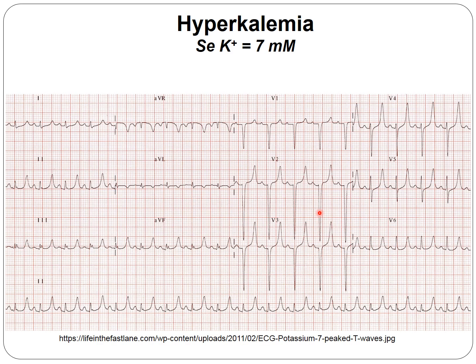This tracing shows a sign of hyperkalemia. As you can see, this is a rhythmic heartbeat. We do have tachycardia because the heartbeats come earlier than 3 big squares. We do have a sinus P wave because it is positive in lead 2 and negative in aVR, and every P is followed by a QRS complex. The PR interval is normal in this situation. The QRS is narrow and the axis is normal. The axis is around 60 degrees, because the equiphasic QRS complex can be seen in aVL.